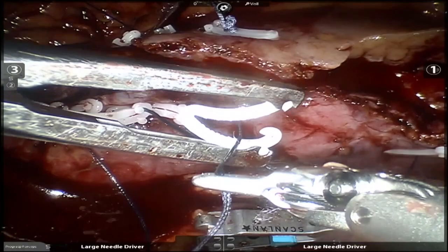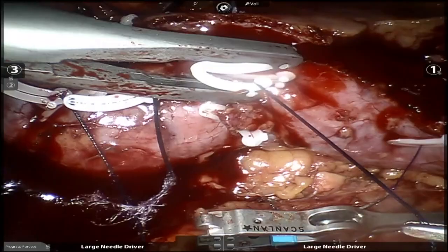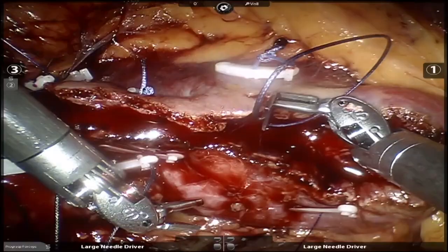So our warm ischemia time is over. It's been over for a while. I don't know what our time was, but Brando, hook it. Yep. Another stitch. Perfect. This is basically just a bunch of cortical bleeding. It's not that bad. We did the majority of our closure on those first two layers.